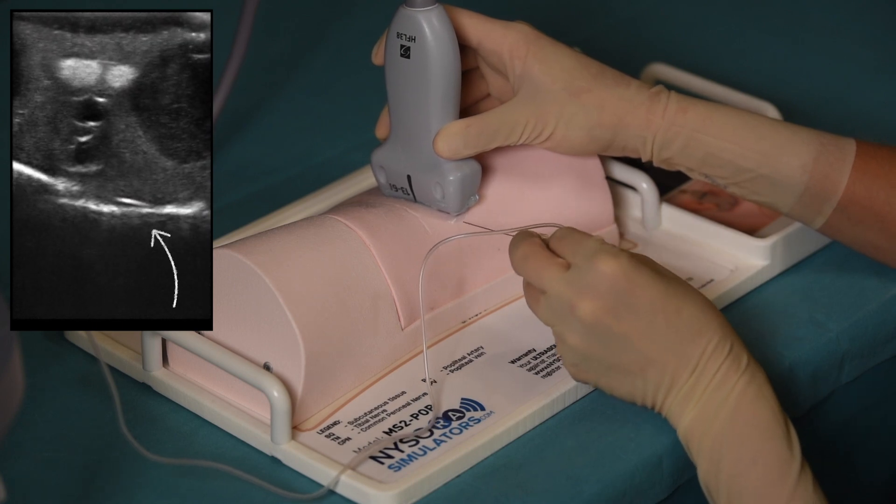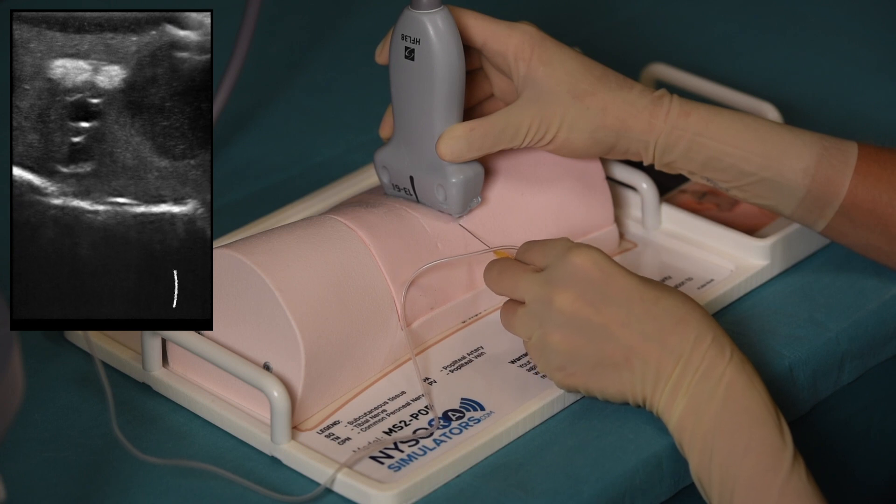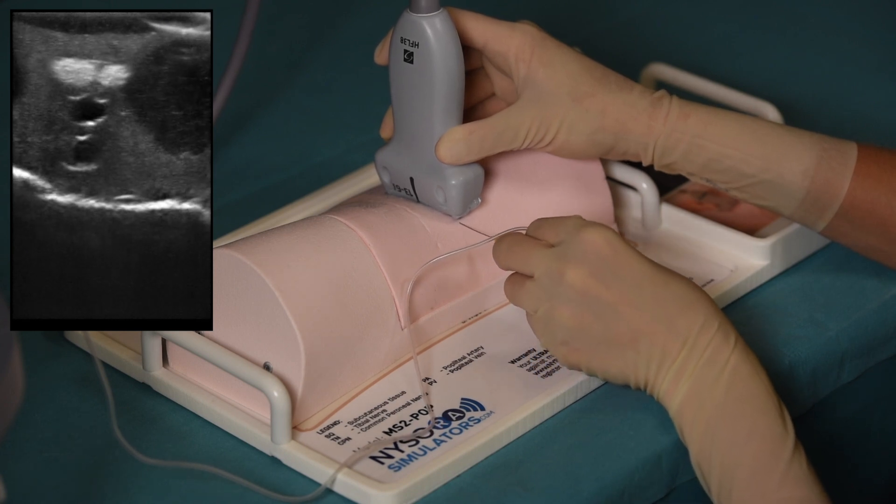At the bottom of the image, we can also see a bright surface, which corresponds to the posterior aspect of the femur, or cortex of the femoral bone.